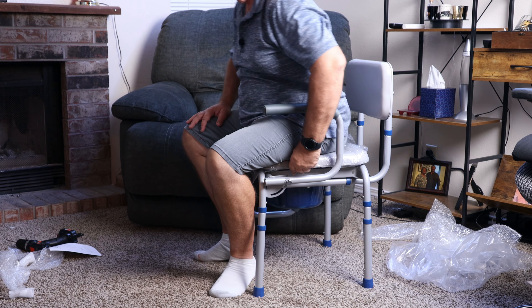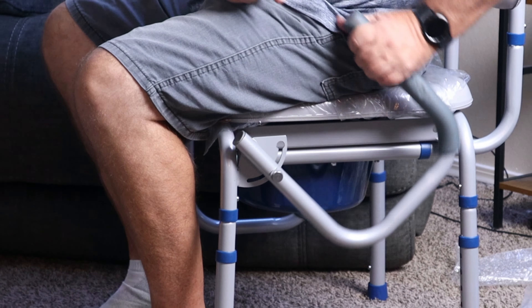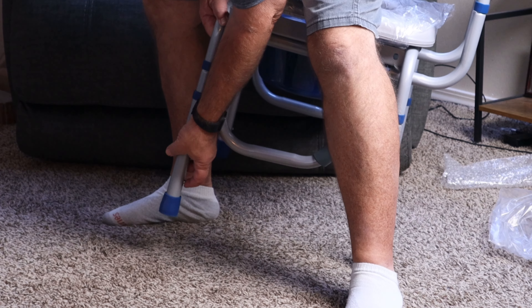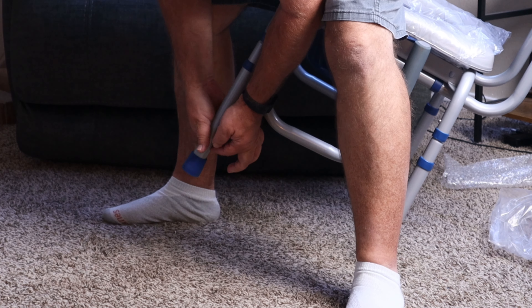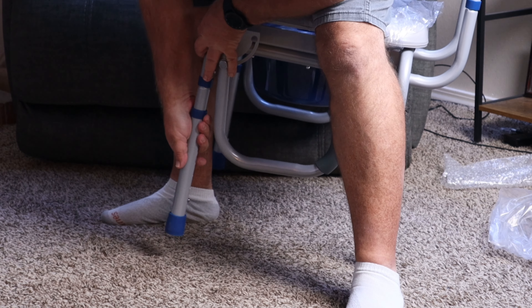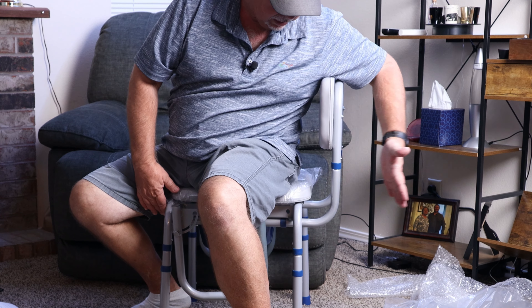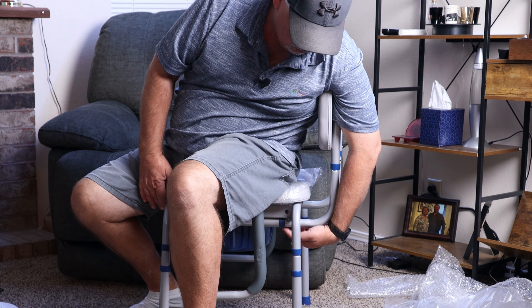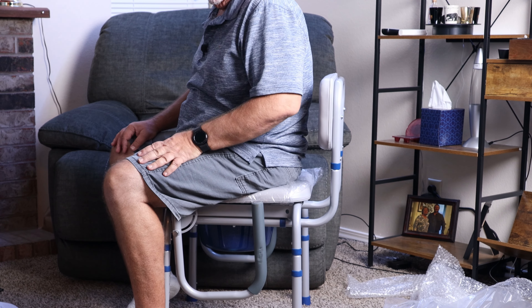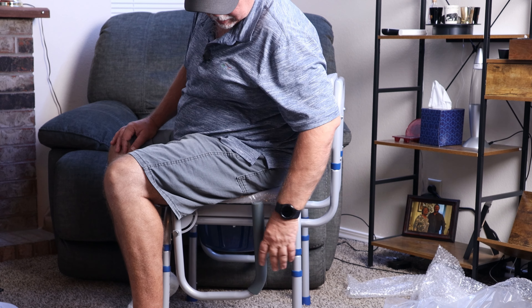It's got a very comfortable seat, actually — that's not bad at all. Like I said, you can lower these arms: just push that pin in and that will lower down, and then you can slide off to the side. The legs are adjustable — just push the little pin right there and you can extend that leg to make it taller if you need to. The back is adjustable too, like we said earlier — you can slide it in and out with the pins underneath. Very nice little chair. This would definitely be nice if you were not able to make it to the restroom for whatever reason.